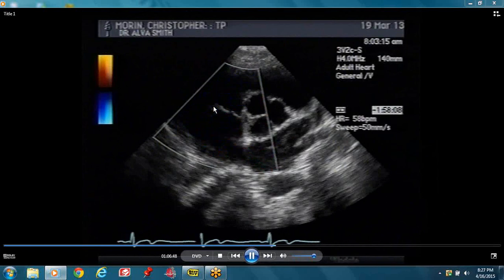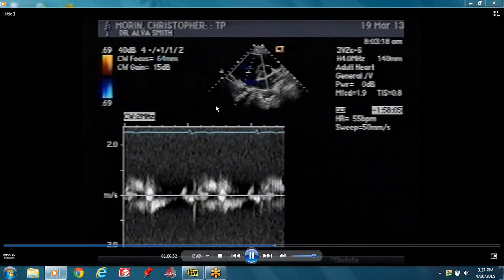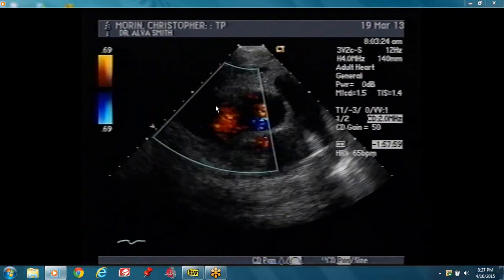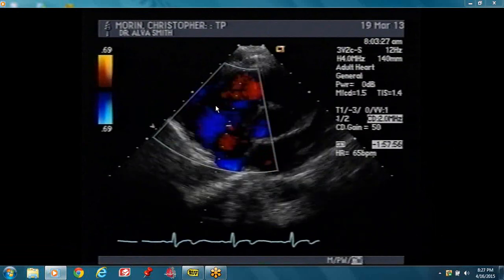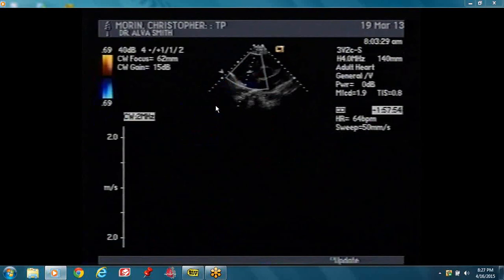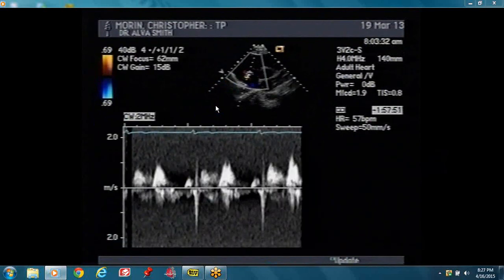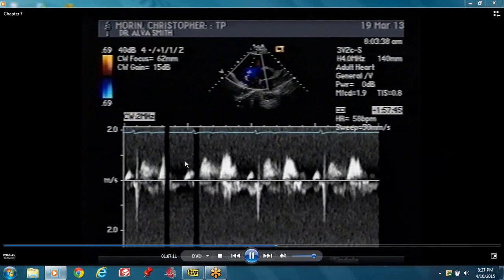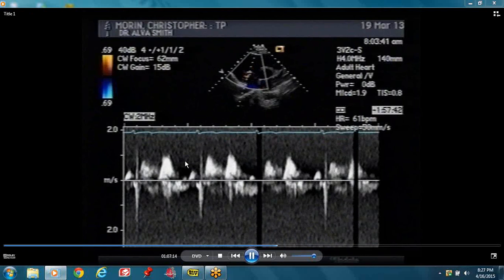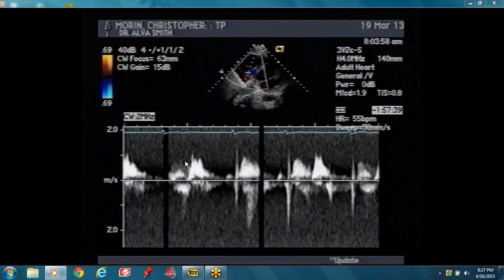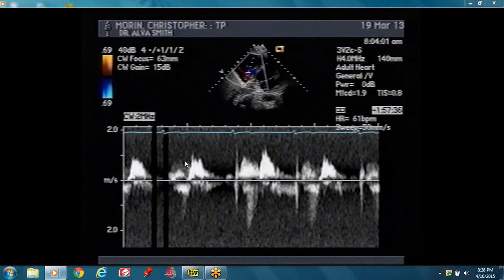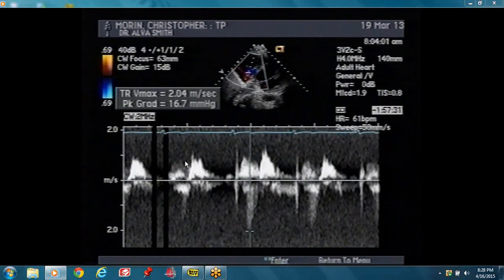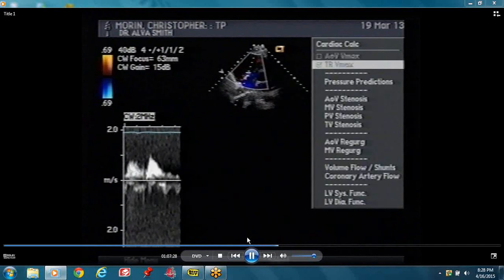She's across the tricuspid valve — not much tricuspid regurgitation. As a matter of fact, there's no tricuspid regurgitation. It's probably physiologic TR, so you don't have to worry about it.